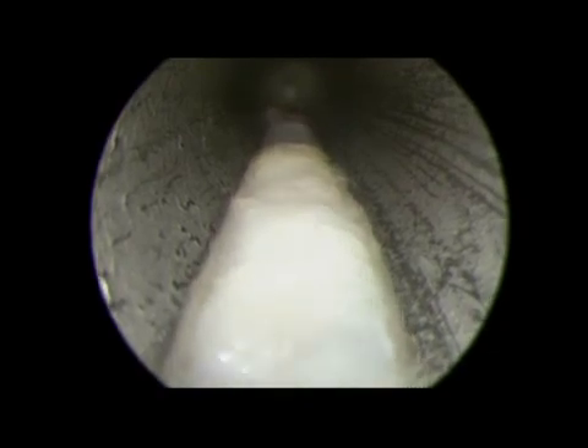The slotted cannula is then rotated 180 degrees to look for the sural nerve. In some patients we can see the sural nerve, and if visible, it can be palpated from outside the cannula.